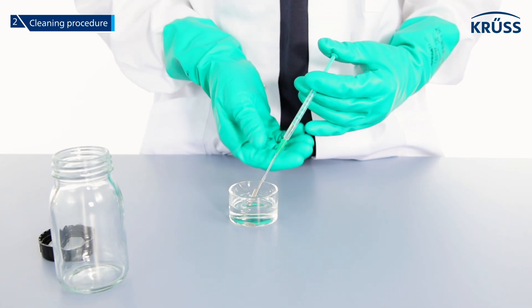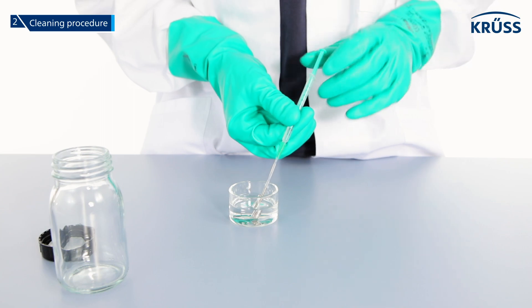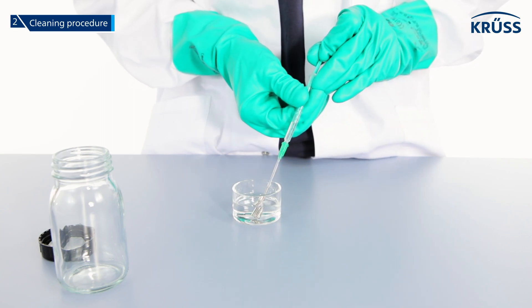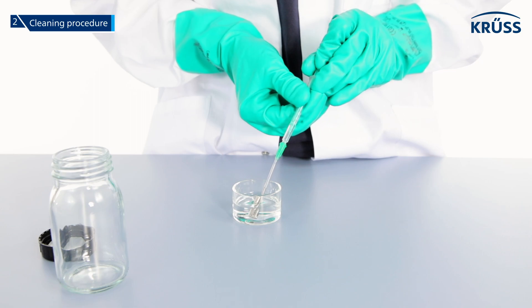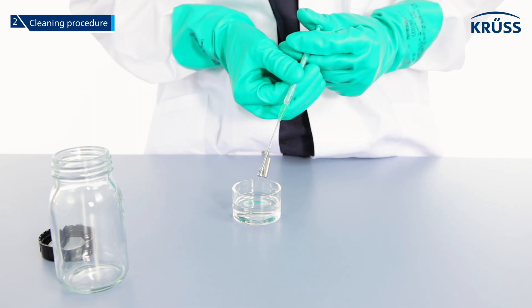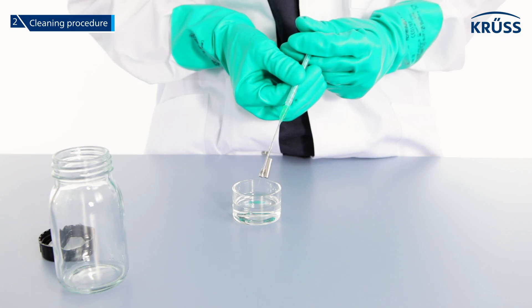Immerse the valve in a sample vessel filled with isopropanol and gently pump the syringe at least five times in both directions. Then discharge the syringe until it is empty.